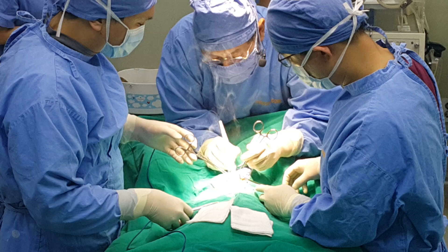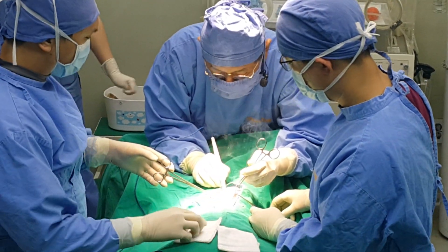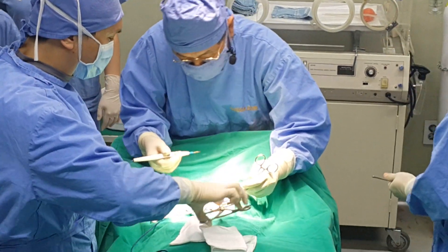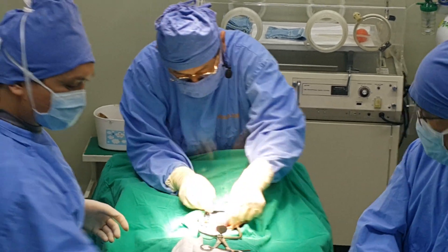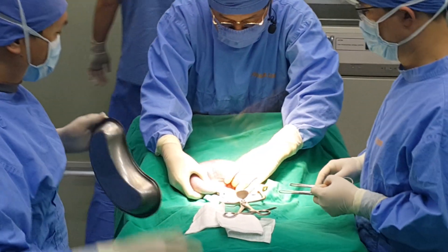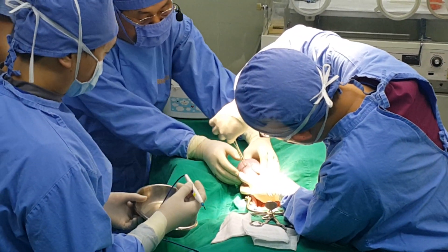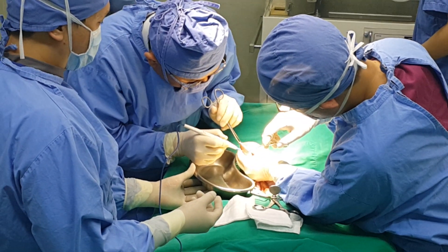The surgical techniques are somewhat of an intellectual property. The scissor instrument he's using is basically an expander — it's to expand and hold open the skin. He's taking out the puppy right now. There's one sack, so it's one puppy. That's the embryonic sack — the puppy is inside. Later you'll see them take out the placenta as well.